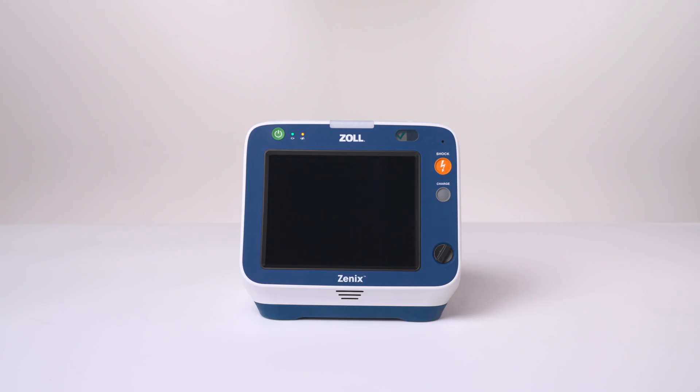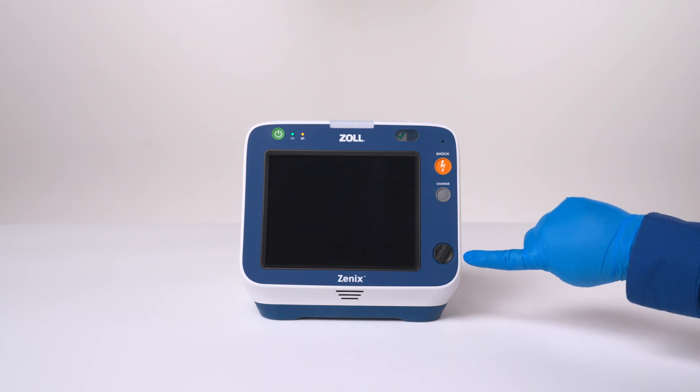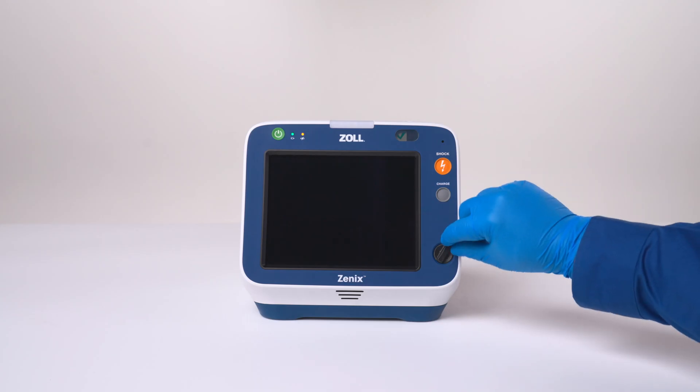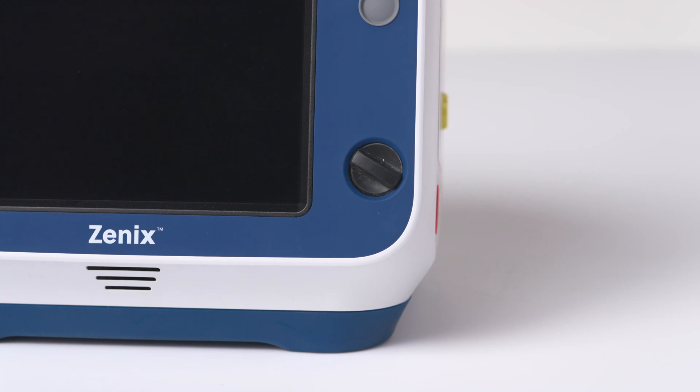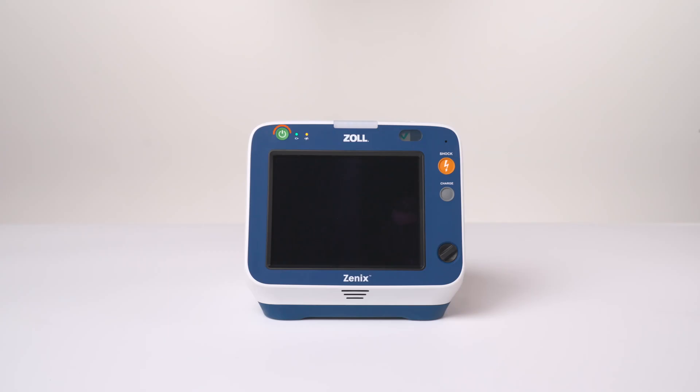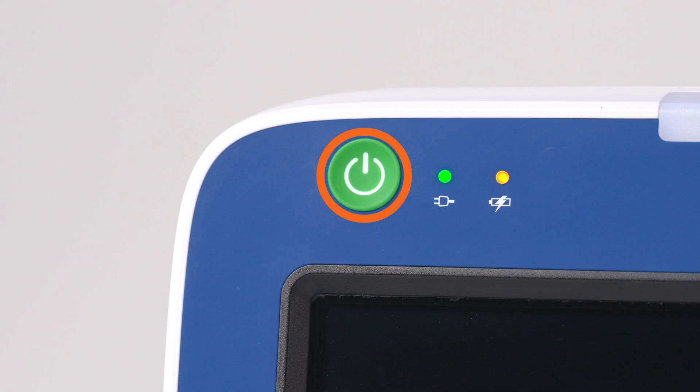Xenix uses either a touch screen interface or a rotary dial for input. Access device functions by selecting the appropriate key or window. A green power button is located on the upper left side. Press it to turn the device on; press and hold the button to turn the device off. Two LED indicators are located next to the power button. The LED indicator on the left shows that Xenix is plugged into auxiliary power. The LED indicator on the right shows battery status.